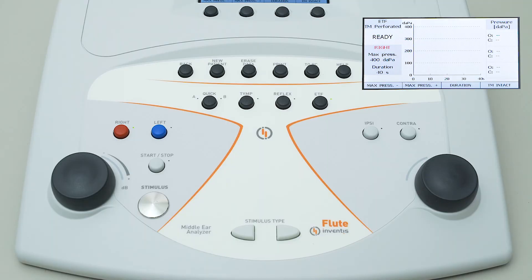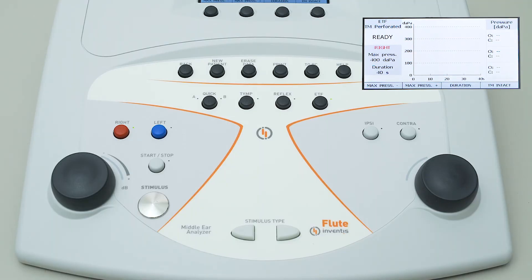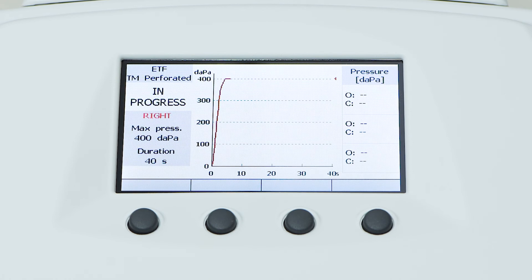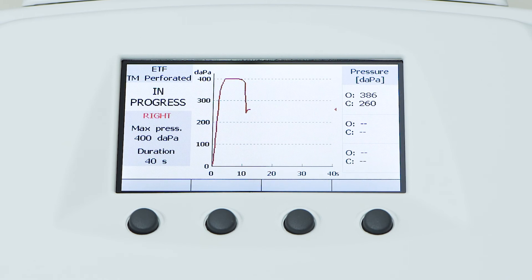Start the exam by simply pressing the start button on the keyboard or the relative button on the control box. Results are calculated automatically and displayed on the right-hand side of the window. The three pairs of numbers are the initial and final pressure values registered during significant pressure variations.